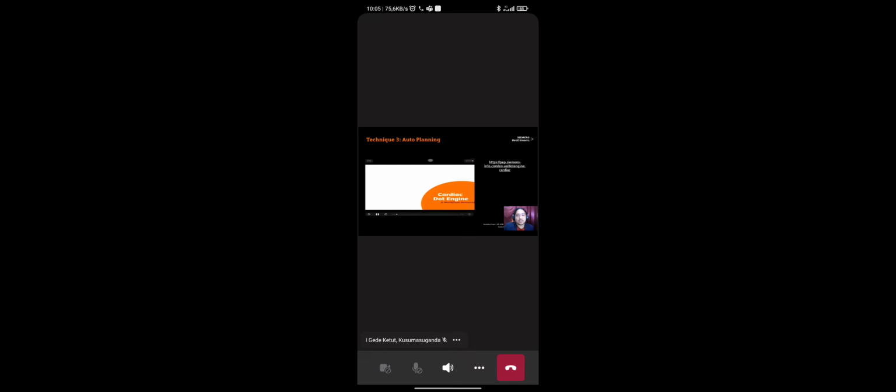Cardiac settings of an opened protocol can be adapted while you are scanning. Simply select the tick boxes of the orientations to be measured and use the quick access to the protocol parameters to update them when needed. You can see what is happening at any point of time. For example, a green protocol is currently running. The Cardiac.engine harnesses our unique standardization and automation technology to make cardiac scans faster and more robust.